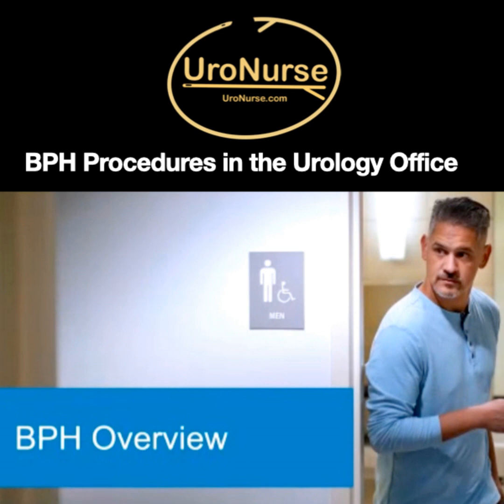Out of curiosity, how do you guys feel about urodynamics before or after a prostate surgery? Sometimes we do it beforehand to look for obstruction. Sometimes we do it afterwards to see if they have an atonic bladder. How do you guys feel about that? Only if you suspect bladder atony.